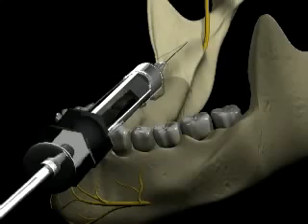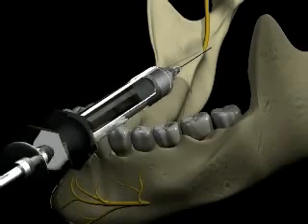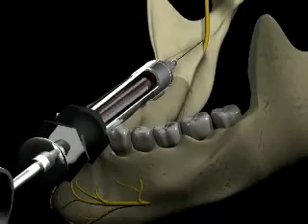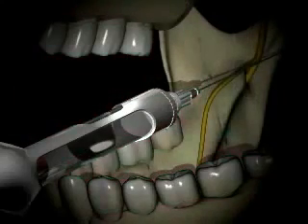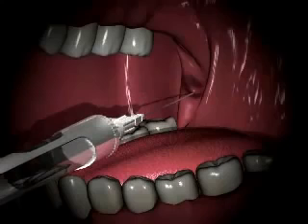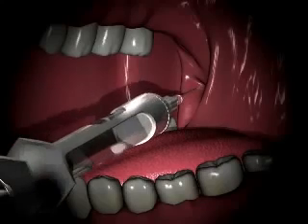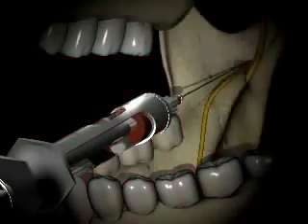This is accomplished by withdrawing the syringe slightly, moving the barrel more medially over contralateral canine or incisors, and advancing again until bone is contacted. If you do not contact bone after 25 millimeters, and the needle is almost buried, you should redirect by withdrawing somewhat, but not completely, and move the barrel of the syringe more laterally and advancing again until bone is contacted. You should repeat this procedure as necessary.